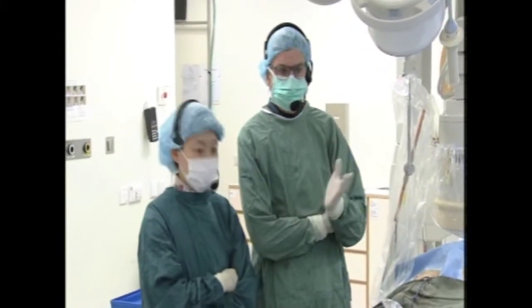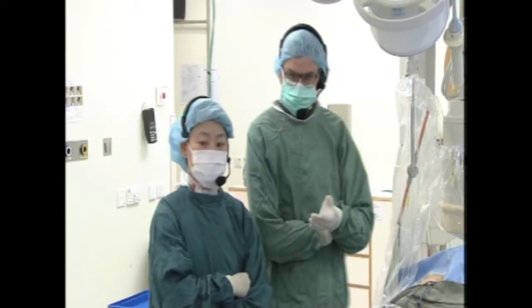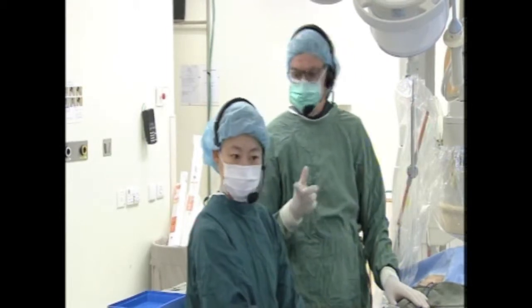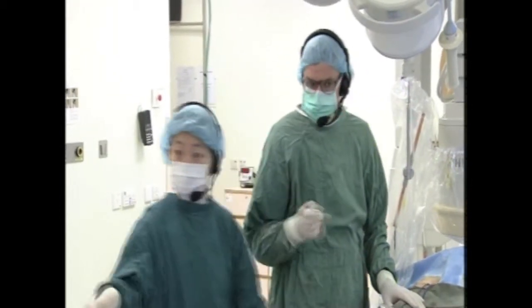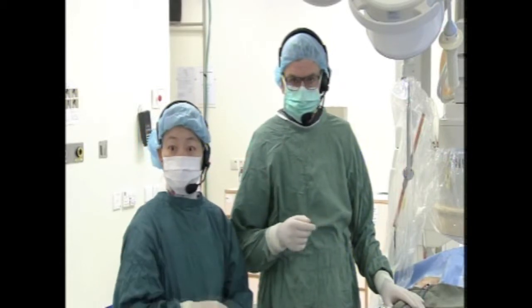Are you ready to deploy the device? We have loaded a 27 millimeter. Don't you do that first before our lecture? A 27 millimeter Occlutech in a 12 French sheath. We can see ICE. Echo, please. Can we see echo?